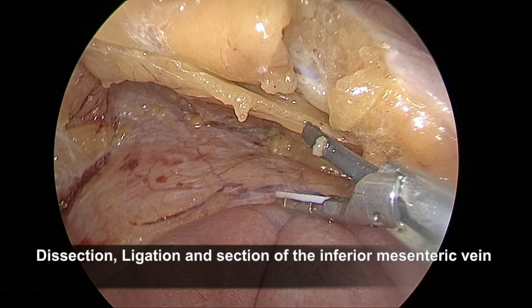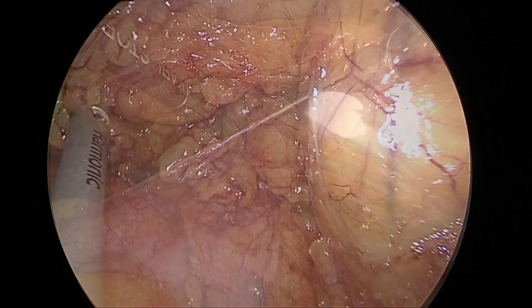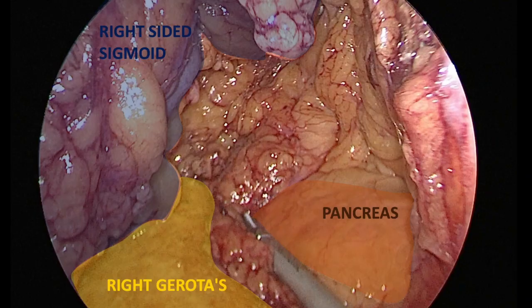We continue with the dissection and ligation of the inferior mesenteric vein. The dissection of the splenic flexure must be done with caution, taking into consideration possible anatomical variations such as polysplenia. After releasing the splenic flexure and separating the mesocolon from the retroperitoneum, we can see the right-sided sigmoid, the right Gerota's fascia, and the pancreas below, in a mirror image.